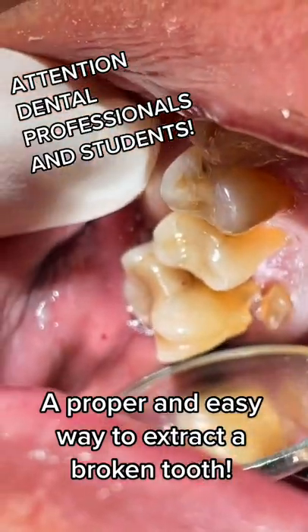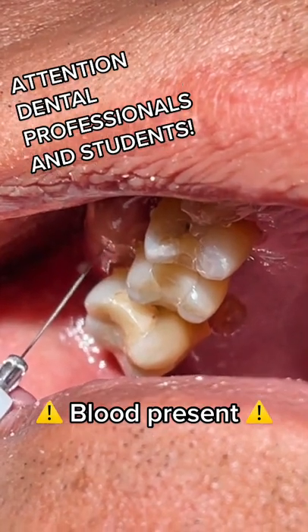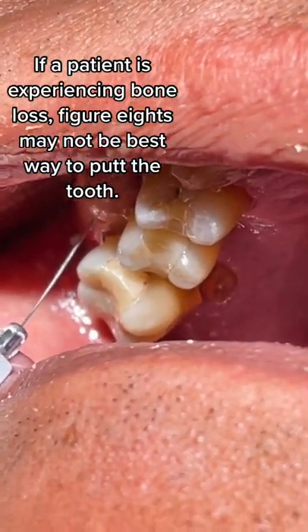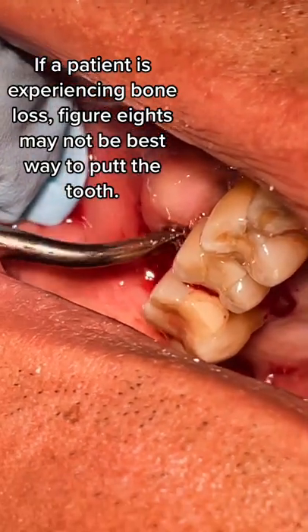A proper and easy way to extract a broken tooth. If a patient is experiencing bone loss, figure eights may not be the best way to pull the tooth.